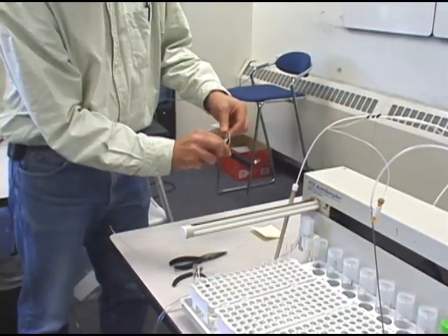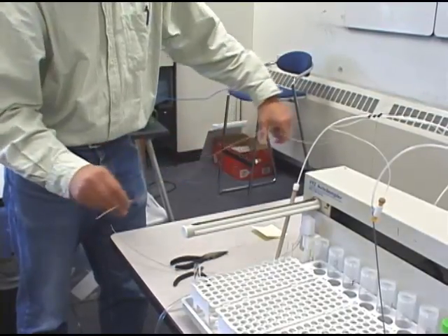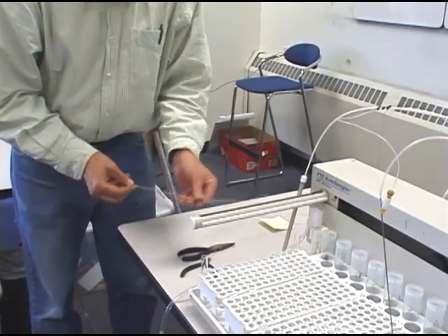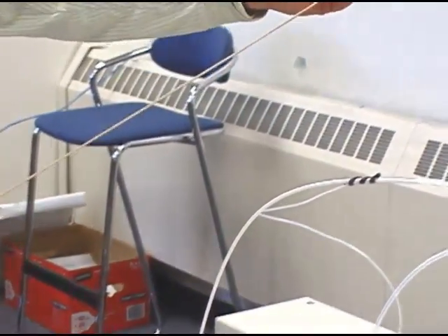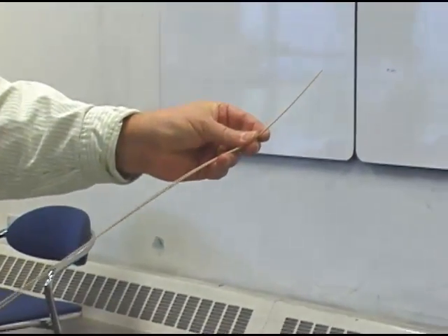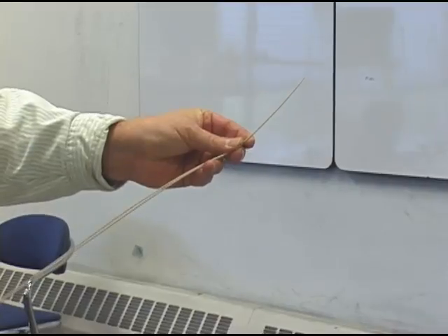Now I'm going to take my new piece of peak tubing and compare it to my old piece and make sure that it's just a little bit longer than the old piece that I took out. Cut it to length if necessary.